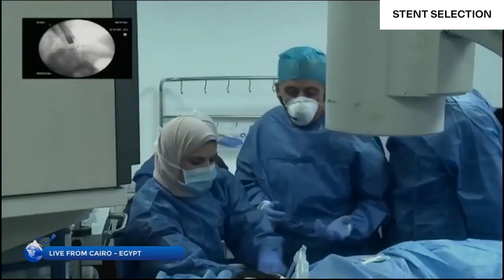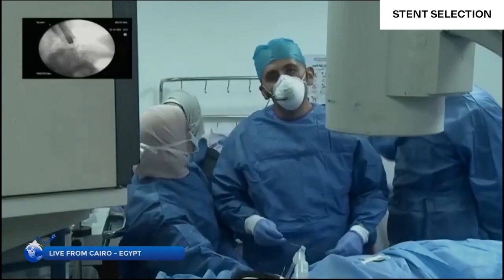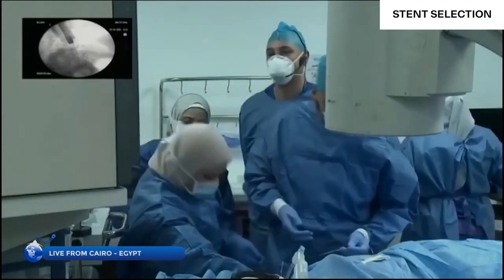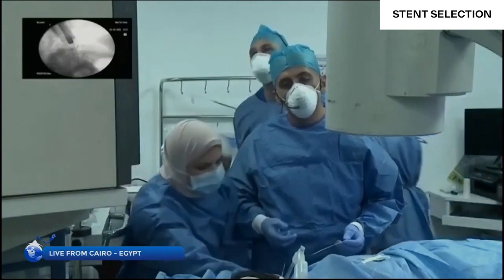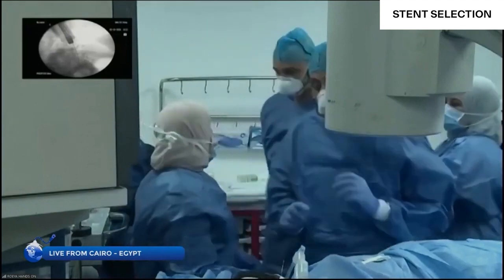Mostafa was influenced by the Belgian school, which does the stent-in-stent technique. Normally we put a partially covered stent, an Ultraflex, where we leave it 6 weeks, and then come back, put a fully covered one inside to do pressure necrosis on the hyperplasia part, and then remove both of them after 1 week. No one, I think, has done a head-to-head study in this world to see which one is better.